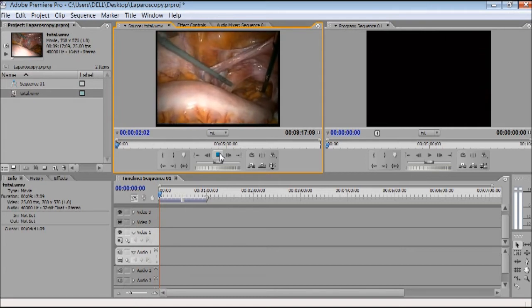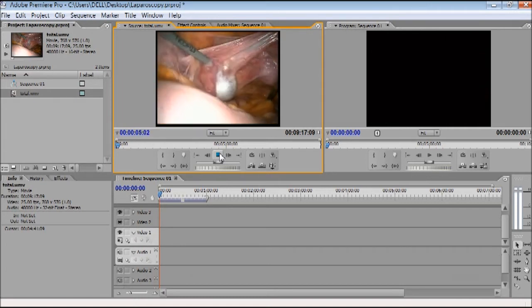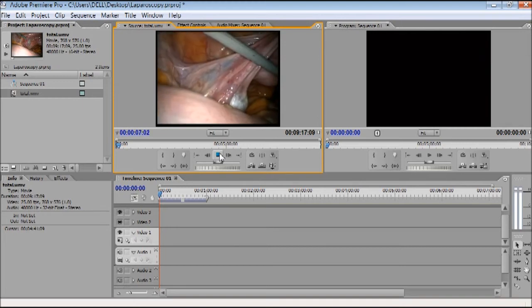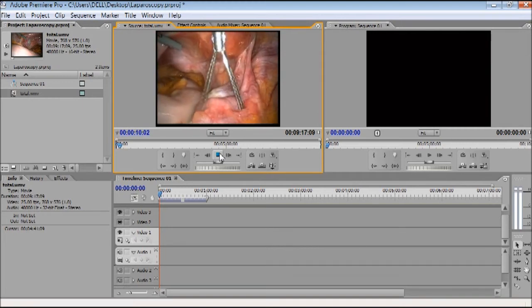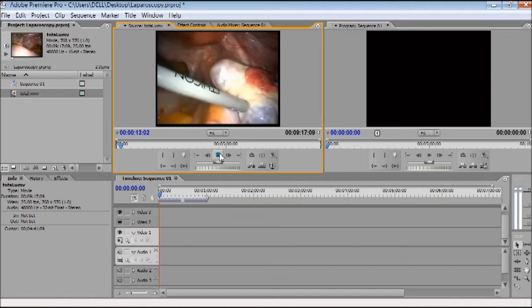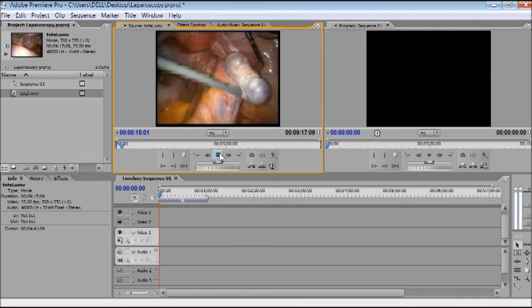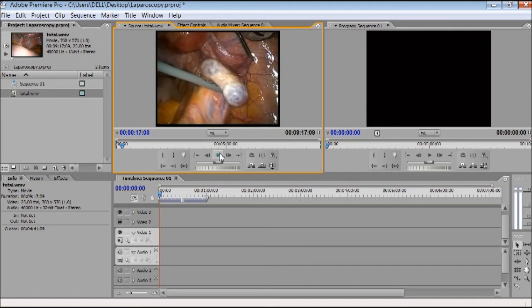The preview shows a salpingo-oophorectomy in a patient with a right adnexal mass using the Harmonic Ace. Following placement of laparoscopic trocars, the abdomen and pelvis are inspected and irrigation is performed to obtain a cytologic sample. We have checked that this video is good enough, and we need to do the editing.